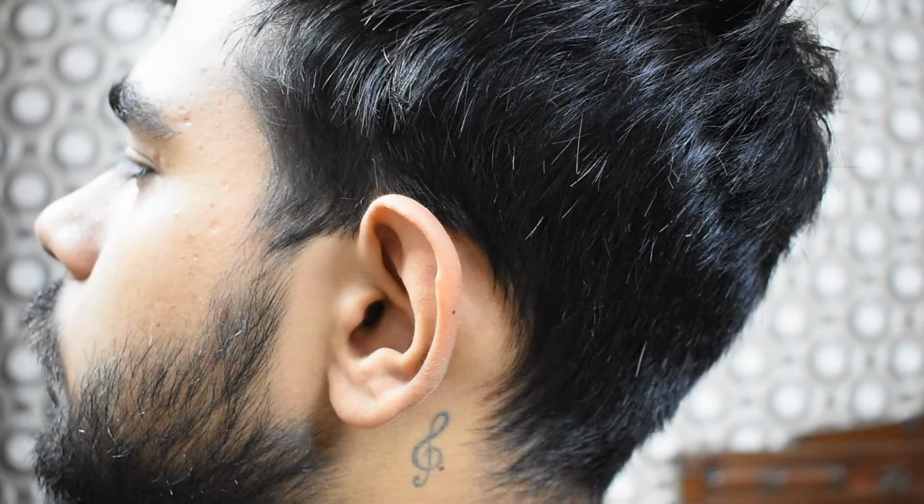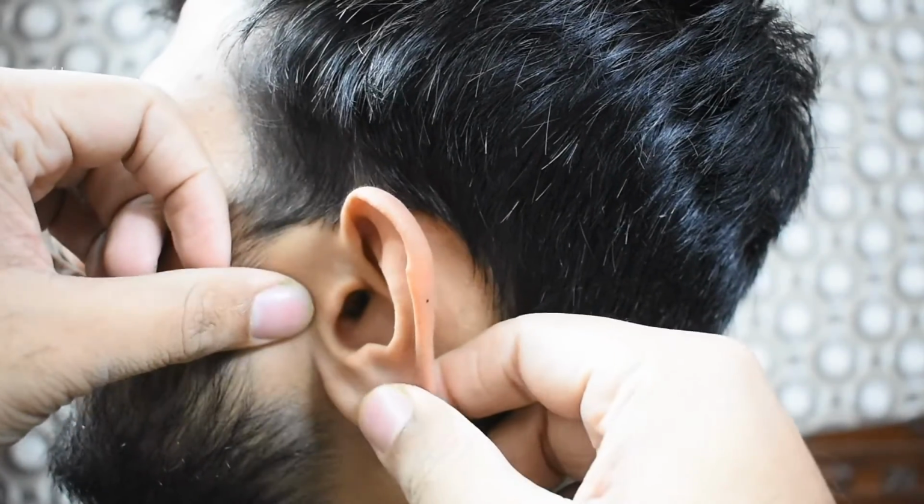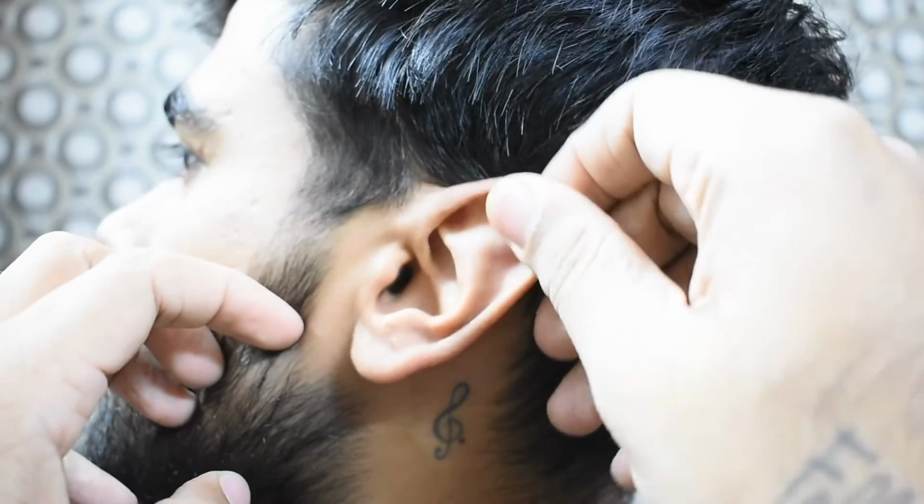The examiner has washed his hands, introduced himself, and explained the procedure to the patient and gained his consent. Begin the examination by inspecting the auricle and the surrounding tissue for any deformity, lumps, or lesions.